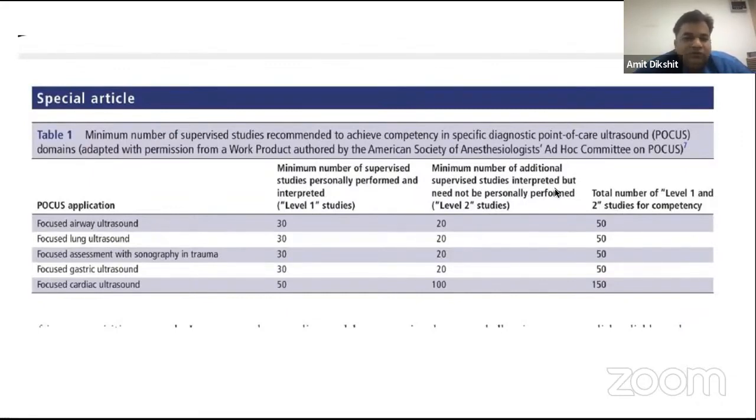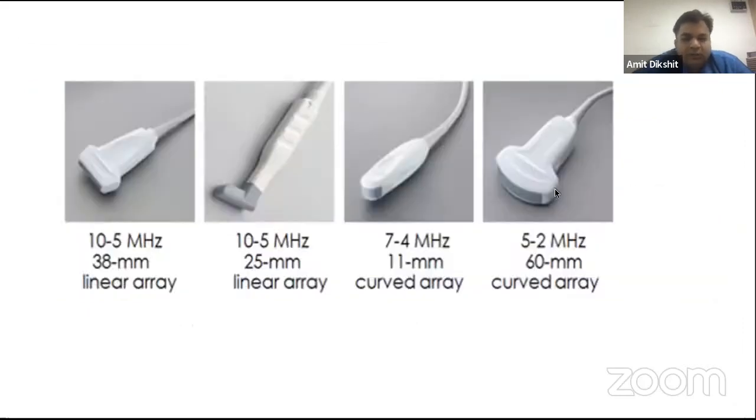So 1 to 2 hours of training is also enough to help them with acquiring good images, and with a little bit of practice they can improve in that. So it's good news for all of us. Different probes: it depends on which airway you are assessing.